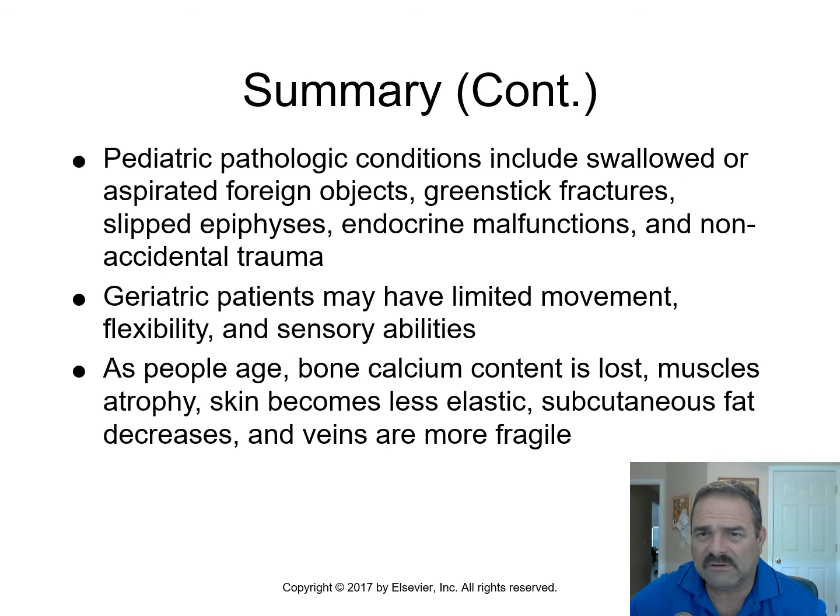Pediatric pathological conditions include swallowed or aspirated foreign body objects, greenstick fractures, remember we talked about that. Any epiphyseal plate type of problems is what we're looking for, some endocrine malfunctions, and non-accidental trauma.